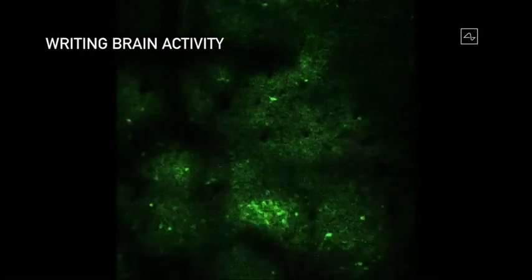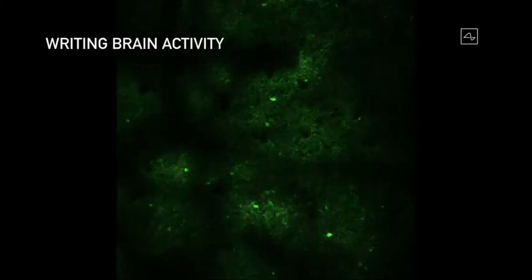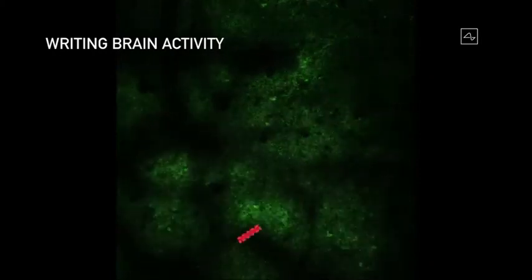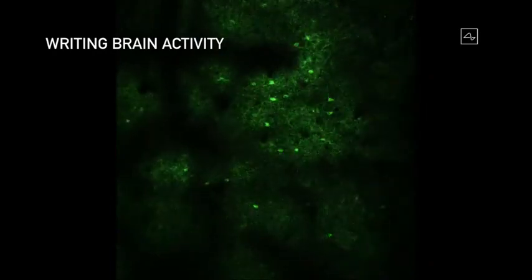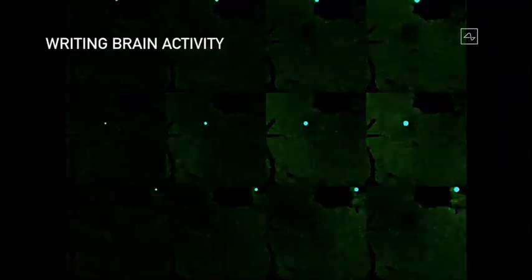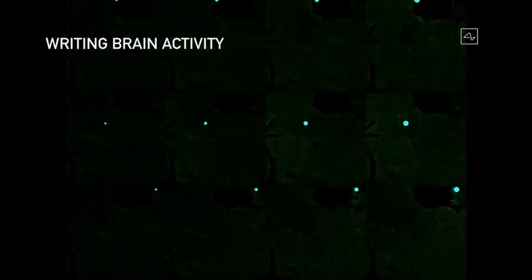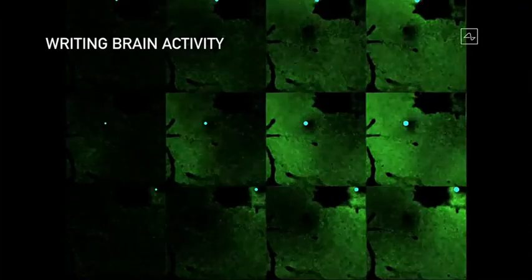So you can see them lighting up different brain regions. And then by carefully controlling the electric field, you can actually have one electrode influence possibly 1,000 or 10,000 neurons. So although you might only have 1,000 electrodes implanted, you could be influencing millions of neurons. And this is just a similar chart showing stimulation at different power levels.